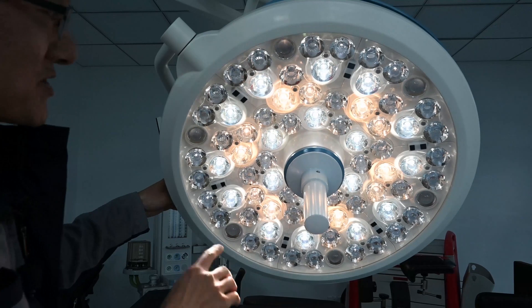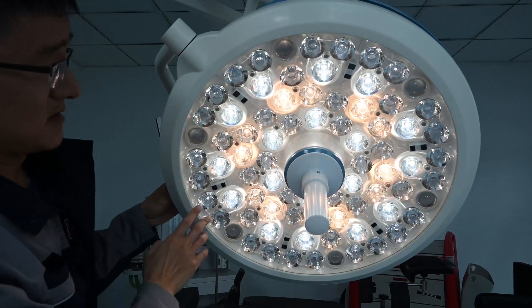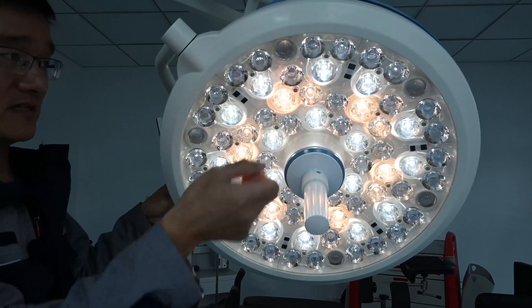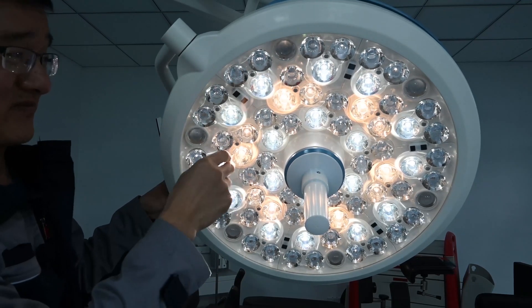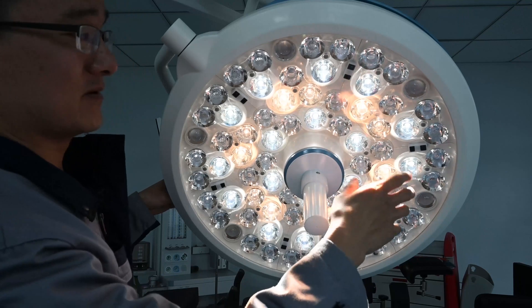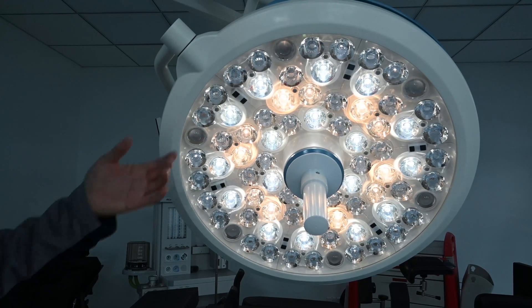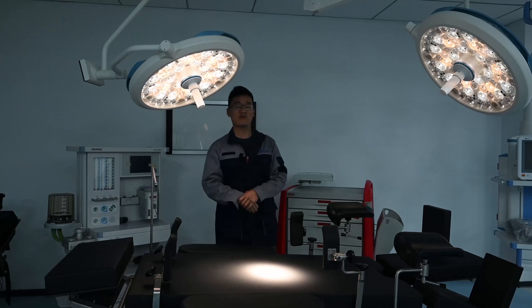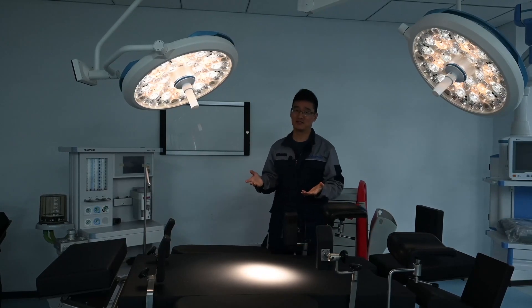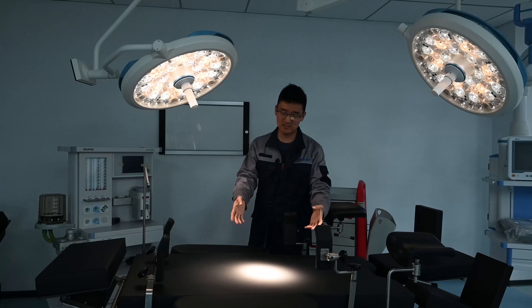For excellent shadow compensation, we adopt new light compensation technology. We have different sensors in the lamp that detect if there is an obstacle underneath. If detected, the sensors send signals to the system, and the other lights increase their power to ensure the light spot maintains the same brightness even with an obstacle underneath. This is the fourth index: the shadowless rate. It means that even with an obstacle under the surgical lamp, we can still see the light spot clearly.